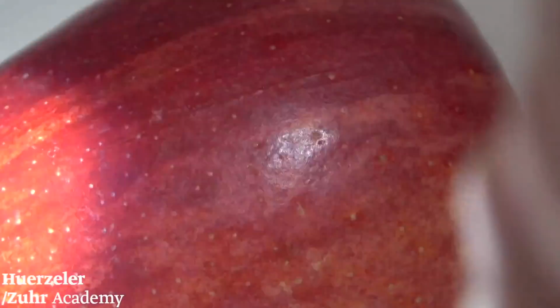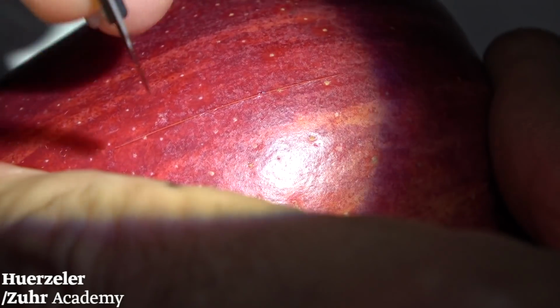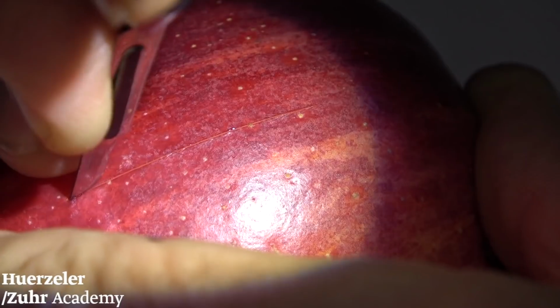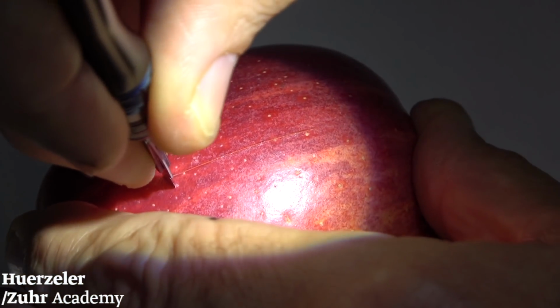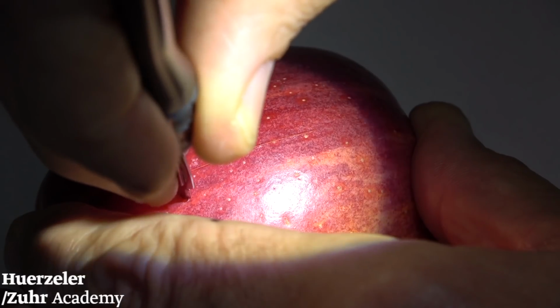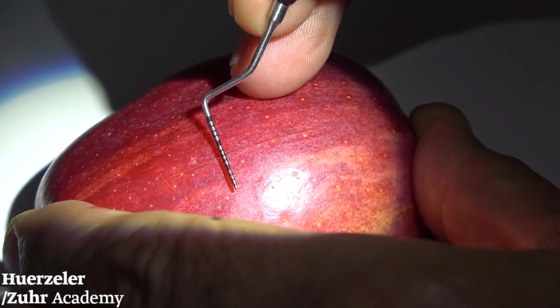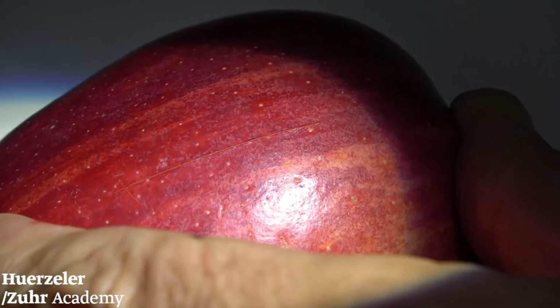Don't harvest too small grafts. Then we do an overcut. Remember what I told you? We overcut in the corner and we harvest a graft which is approximately 9 to 10 millimeters. That's what we want.